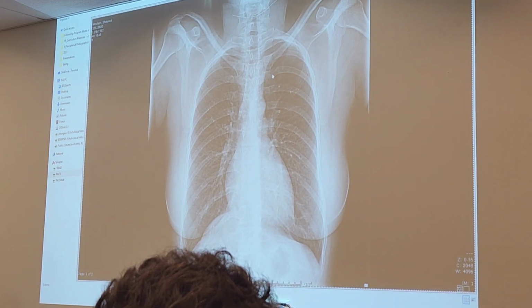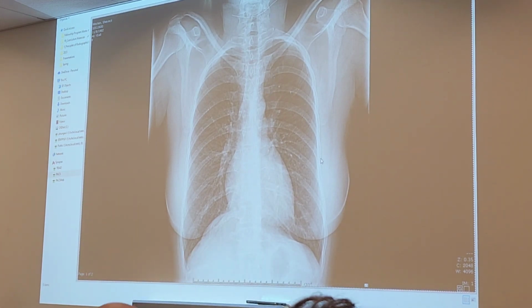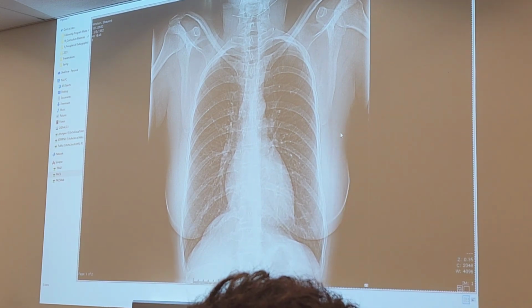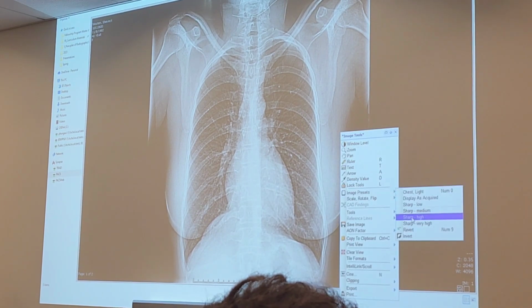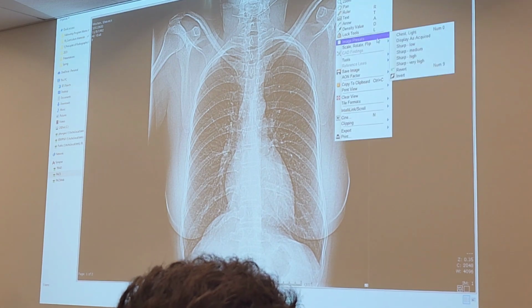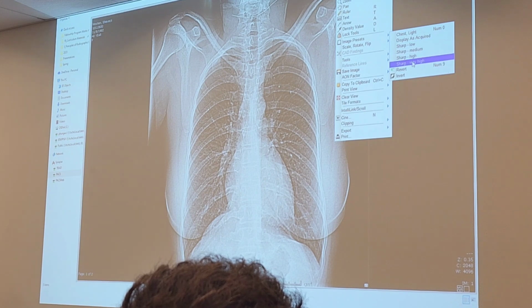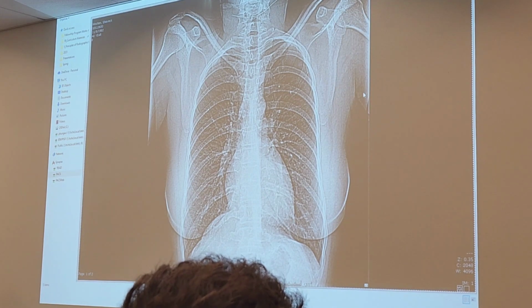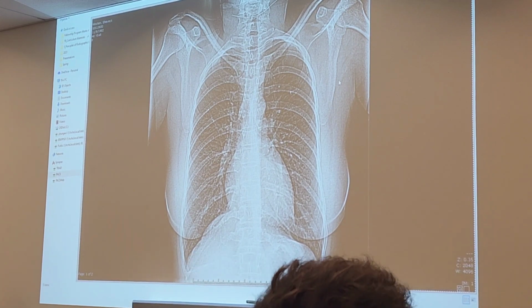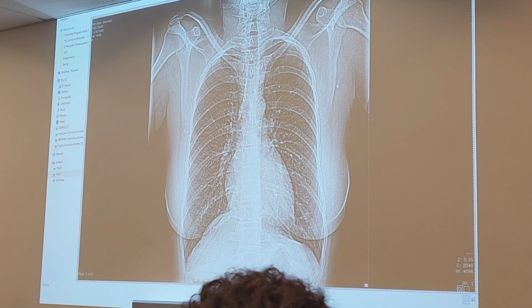It shows up a little bit more clearly now, right? So that's sharp low. So yes, this is low edge enhancement, medium edge enhancement, high edge enhancement. They do have a mask on, I noticed that, right? Super high edge enhancement. So this needs to be collimated more, right? This could be collimated more, yes.